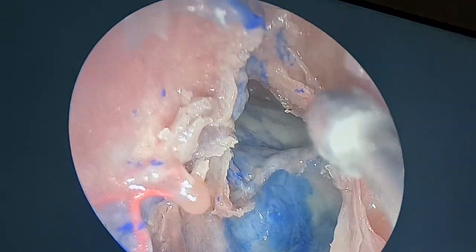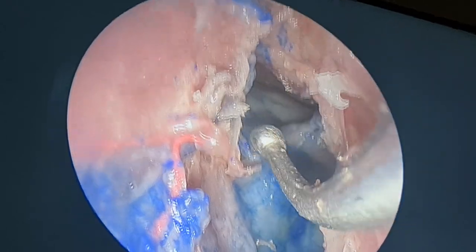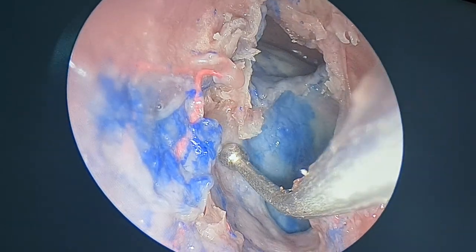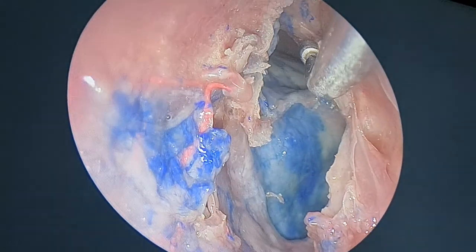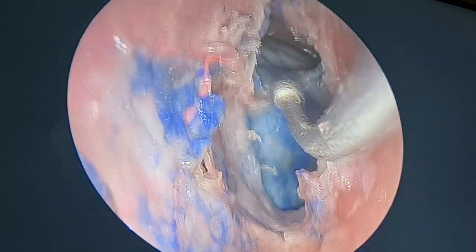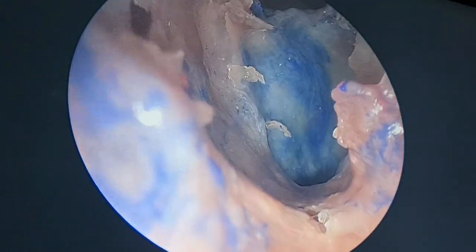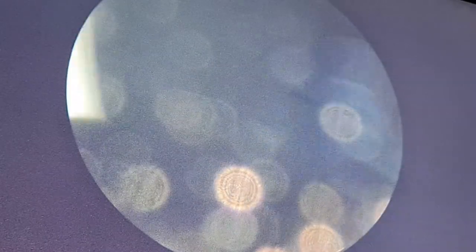Once you are working from the frontal along the beak, see, I was going along the beak. All this is far behind. Once you work along the beak for the frontal, everything is miles away. You don't have to even bother about it. You don't need to look at where your lateral lamella is, where your anterior ethmoidal artery is. You are miles away from this, because your trajectory, your direction, is different, far anteriorly towards the beak. Okay? Now, having done this, I will again switch to the 0 degree for your orientation on the fixed cadaver.